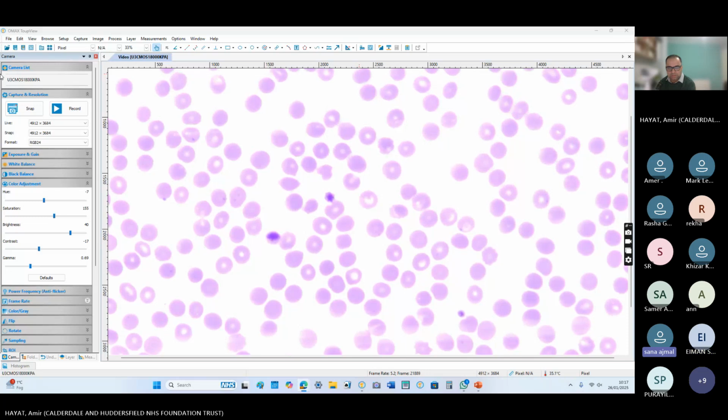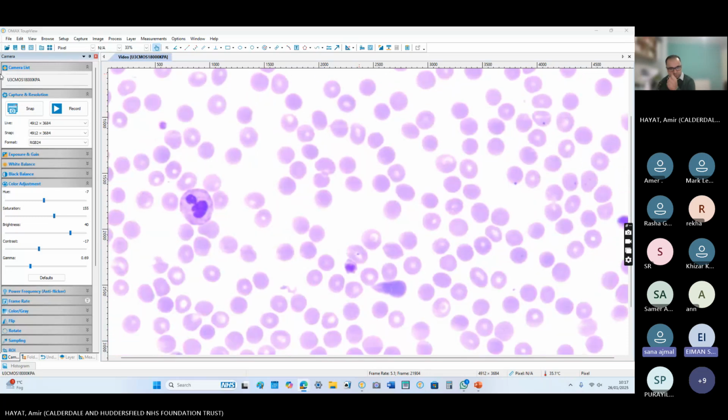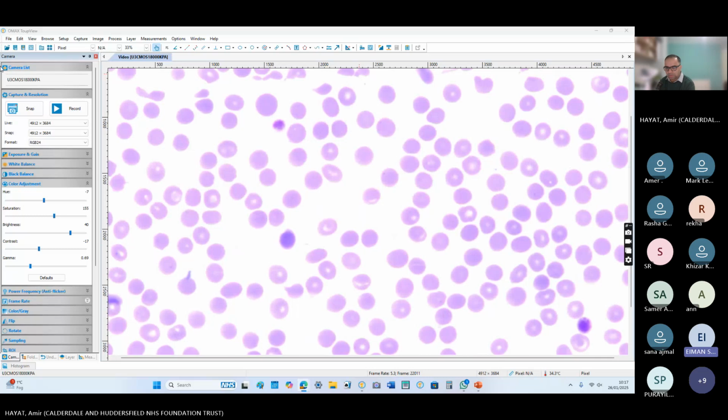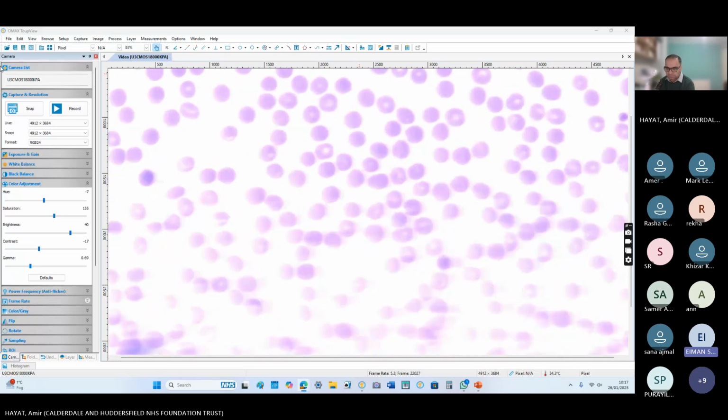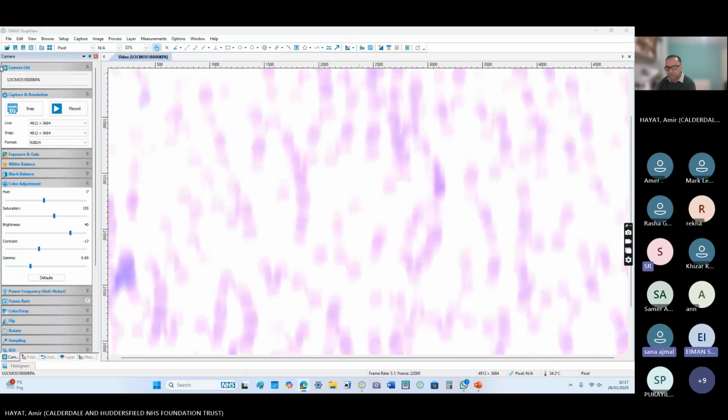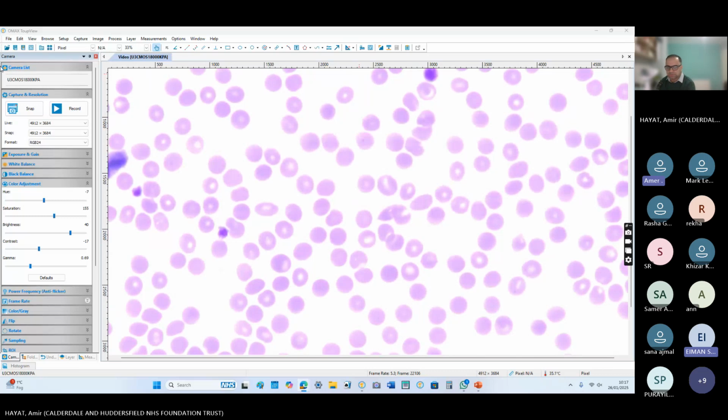So the main differential was with Bernard-Soulier. What are the differential diagnoses of large MPV? May-Hegglin, Bernard-Soulier, gray platelet, CATCH22, GATA mutation. These are all macrothrombocytopenias. CATCH22 is not common, GATA is not common; Bernard-Soulier is okay, MYH9 is okay. What else? Von Willebrand type 2B. Yes, this is common. You need to check for that.